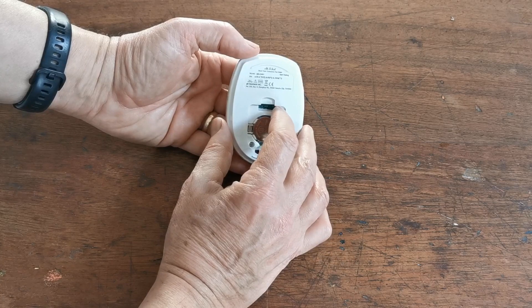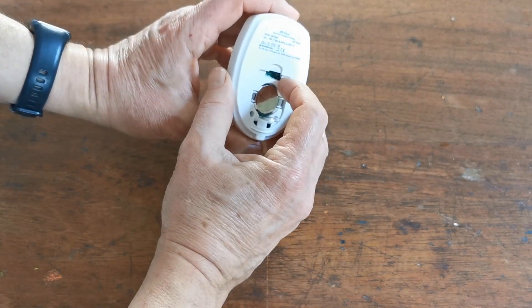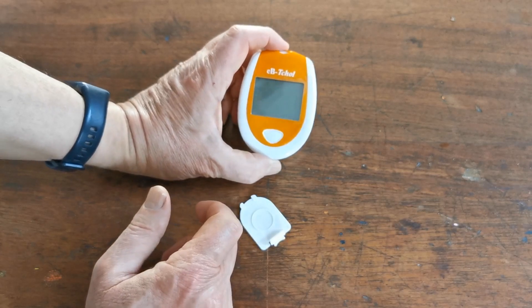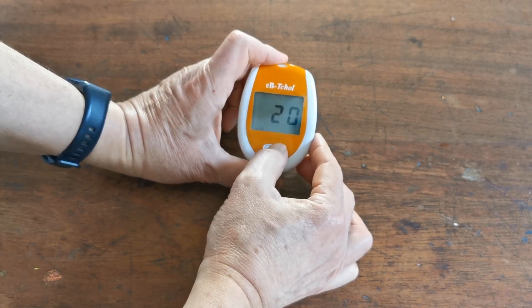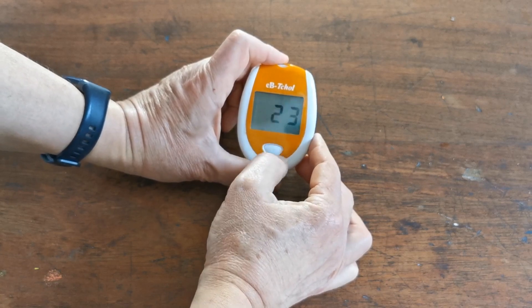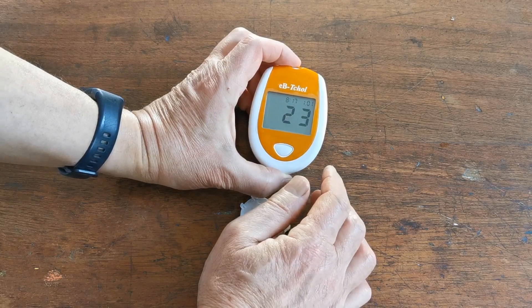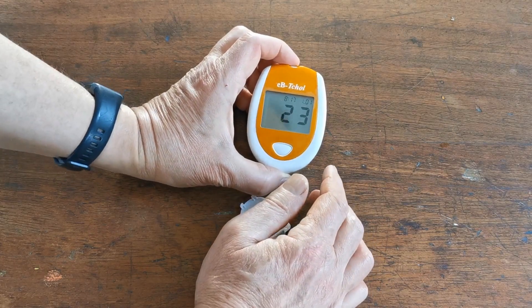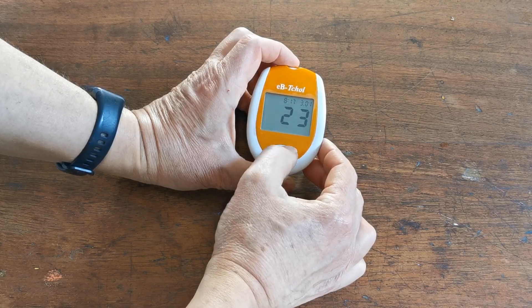Don't put the battery compartment lid back on yet because you won't have access to the little settings button. If I press that once, it's asking me to set the year. Press through to select 2023. Press again when you're happy, and it's asking me to set the actual month — not January or February, it's March.